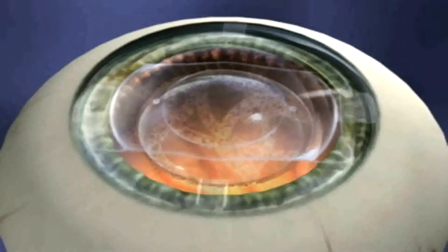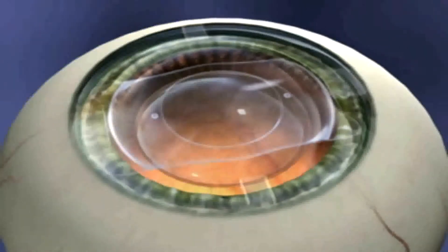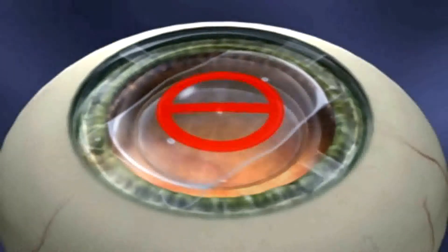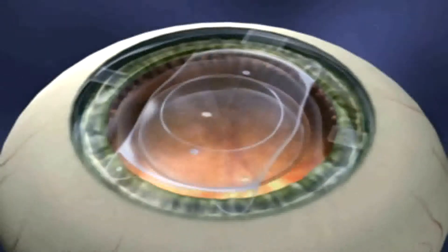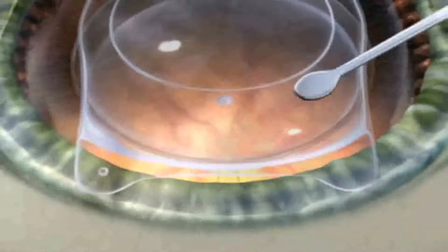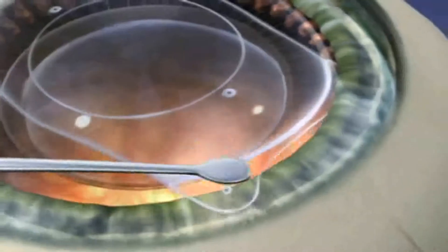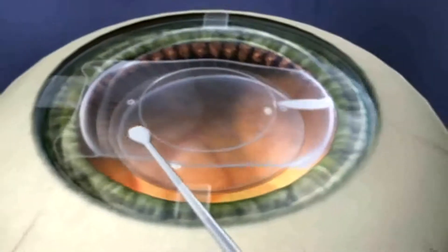Now the ICL must be repositioned posterior to the iris plane via the paracentesis using the ICL manipulation instrument. Keep in mind that the central 6 mm of the ICL is considered the no-touch zone. Avoid going across the visual axis. Manipulate on the peripheral area, never on the optic. Using the ICL manipulator, position the distal footplates first while the pupil is maximally dilated. Once the first footplate is under the iris, continue with each of the footplates until they are all posterior to the iris.